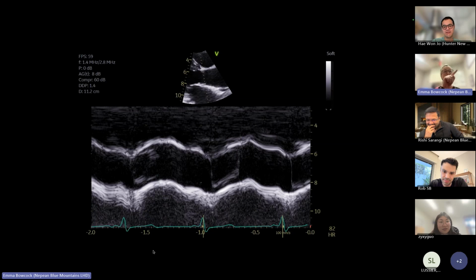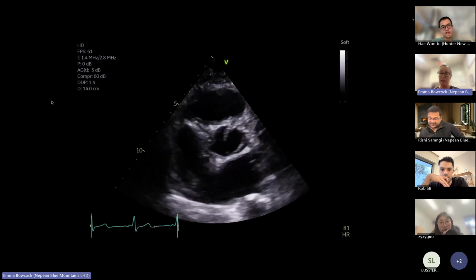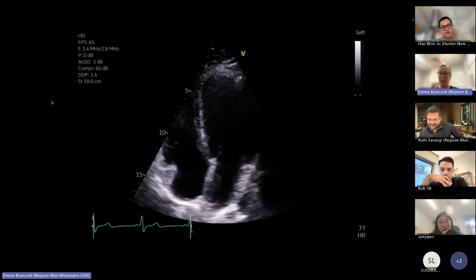But anyway, normally you'd have the line in the middle, where they come back together, and it'd be equidistant. Your aortic valve opens and then your line would be sort of in the middle, then it would open again and your line would still sort of be in the middle. But with a bicuspid aortic valve, that line is eccentric, i.e. it's not quite in the middle. So it's off to one side. And this is a true bicuspid, as you said, so Sievers type 0, no raphe.